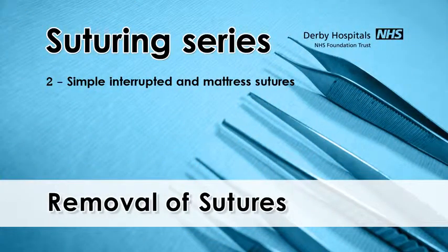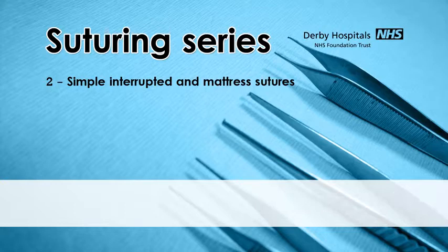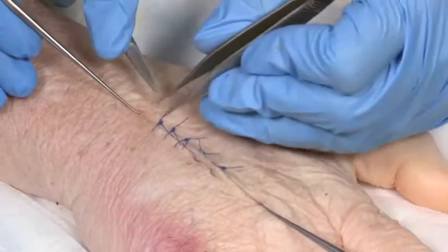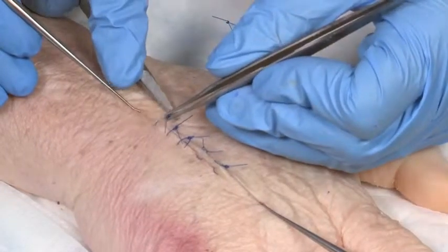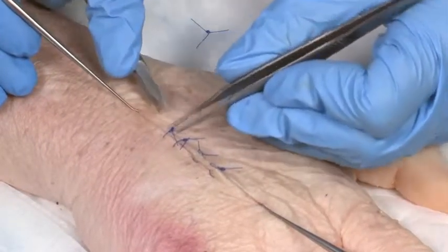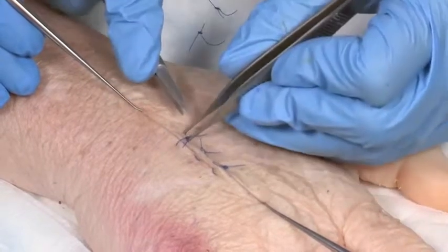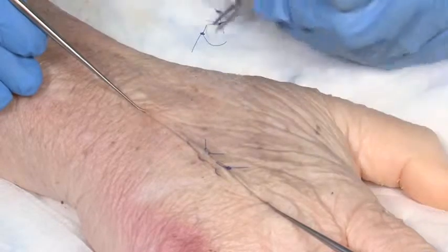Removal of sutures. Pick up the suture by the loose ends and cut one side of the suture as close to the skin as possible. This minimises the amount of suture material that has been exposed to the outside passing through the wound. Remove the mattress suture in much the same way.